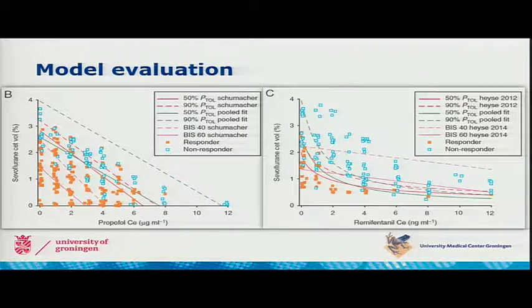On the other edge of the spectrum, the PTOL 90 falls below the BIS 60. So at higher concentrations, starting from a little under 4 nanograms per milliliter, BIS of 60 will be plenty to ensure a good probability of tolerance. And this is likely due to the fact that remifentanil has a profound effect on tolerance of noxious stimuli, but only has little effect on EEG parameters.